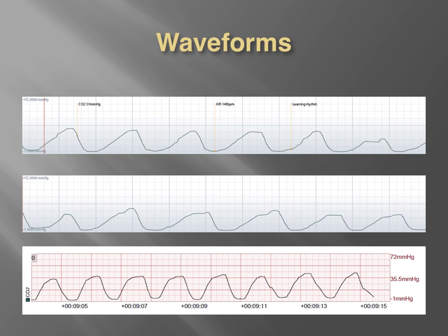This patient was an asthmatic that called us a little bit later into the game, and with our initial assessment, decreased lung volume as far as being able to hear anything, and this is what we were finding on our waveform analysis when we hooked up the capnography for the initial assessment. And these first two are the same fellow, and this is pre-CPAP for us in conjunction with aerosols, where we normally did not do CPAP for those types of patients, which we are now.